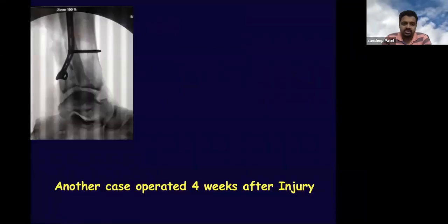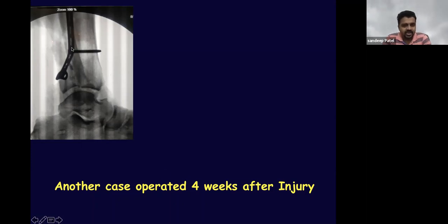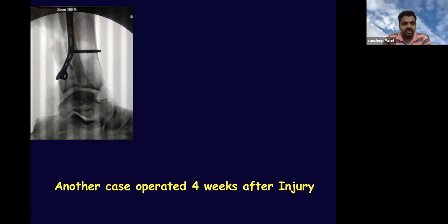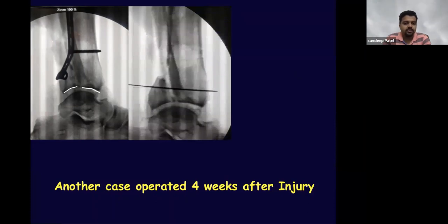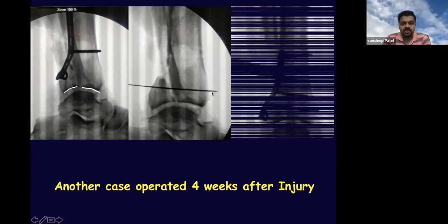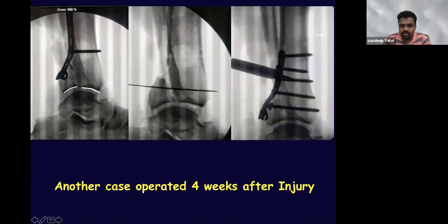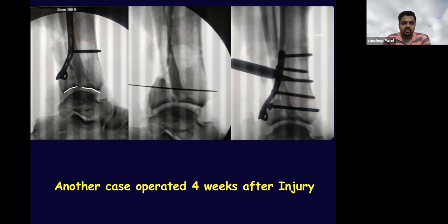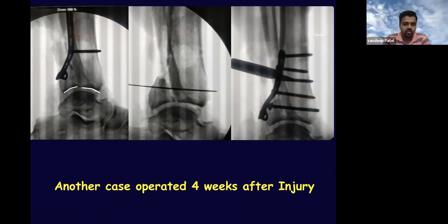However, this is not always the case. In another case operated four weeks after injury, even after buttressing, the reduction was not anatomical — a non-congruent reduction. The textbook teaching is: don't buttress first; achieve reduction first using a cannulated guide wire for a small fragment cannulated system, then put the screw and obtain a congruent reduction, then put the plate. As you get more expertise, buttress reduction can be done in most cases, but this case is shown to illustrate the textbook technique.